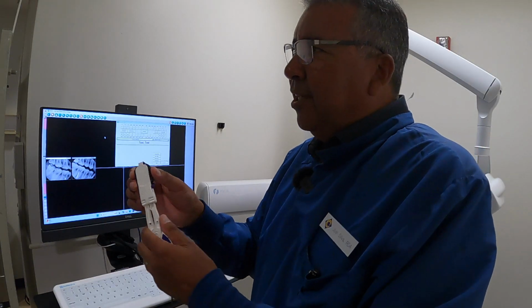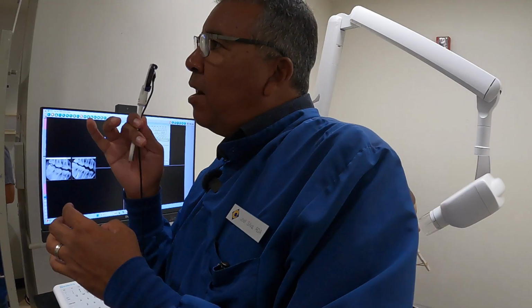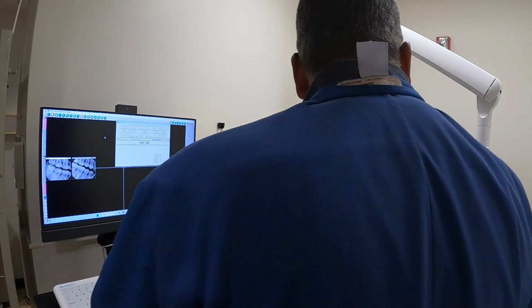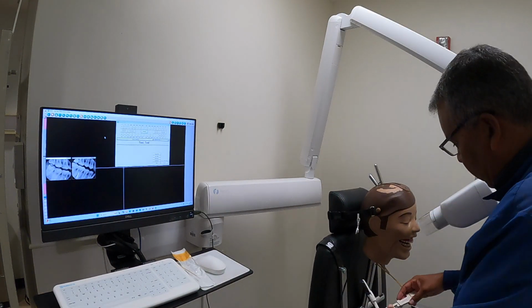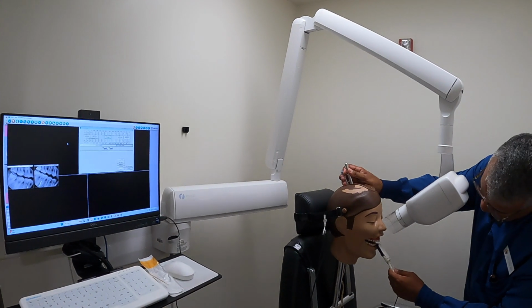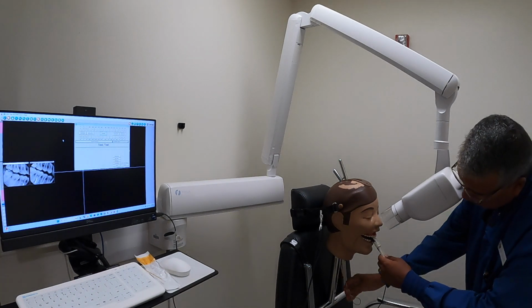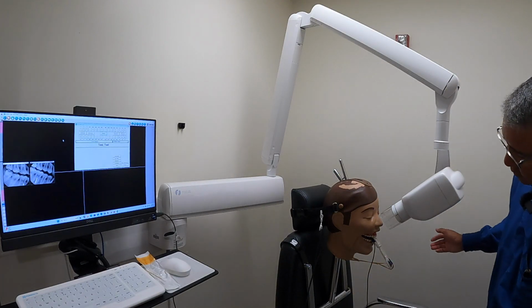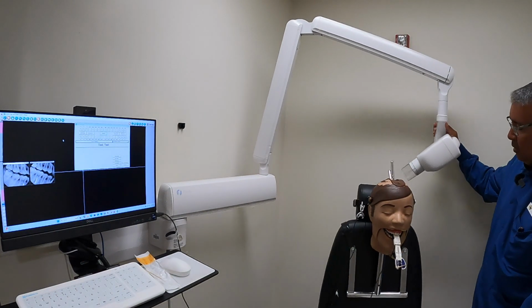But this is more rigid. It's stiffer. It's not as comfortable to the patient, and it kind of rocks sometimes in the patient's mouth because of the curvature of the palate. So when I take this one out and place this one in, right about there. Okay, now I'm going to turn it this way so you can all look at it.